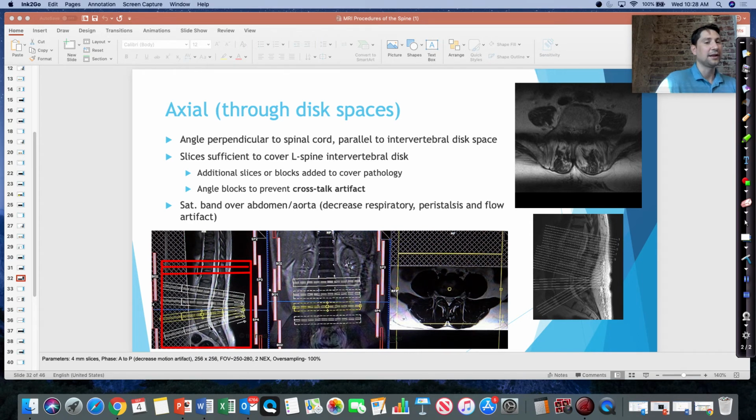But then it's going to kind of screw up down here because see how the spinal column kind of goes in and then out again? So that's why some places do a stack and some places do the individual slices. It's all just depending on where you're at. But Emory tends to do the stack, and Resurgence tends to do like the individual slices.